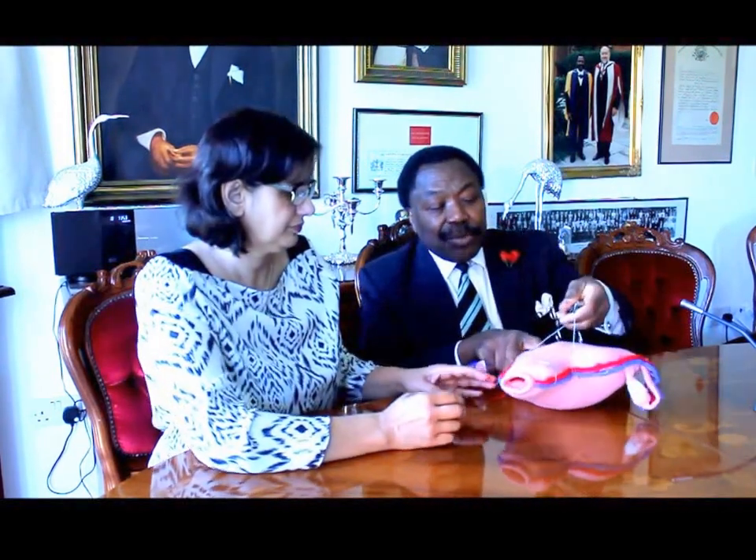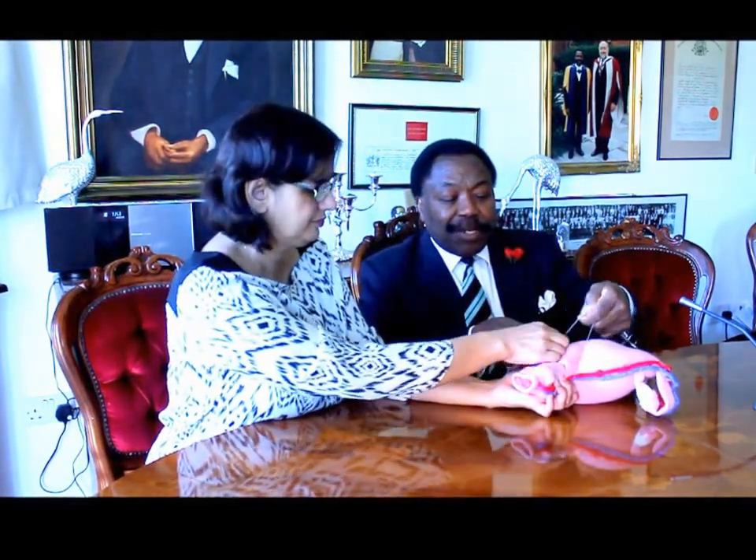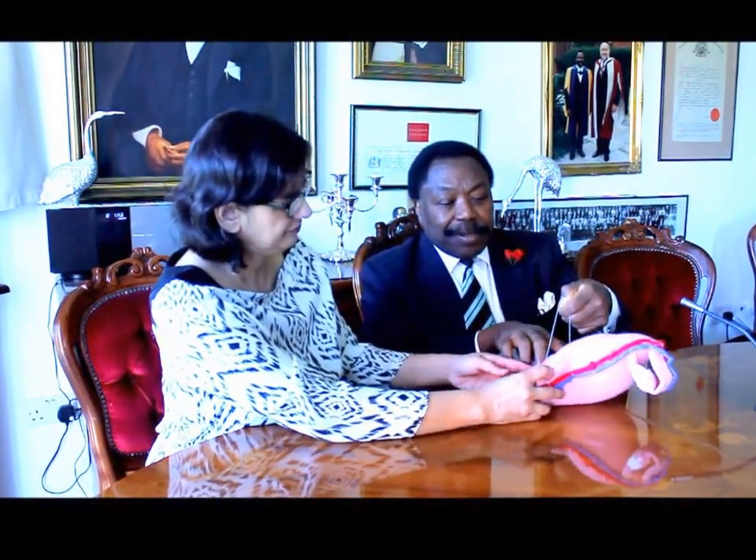You will see the two limbs of the suture surfacing. The assistant or surgeon will squeeze or compress the lower segment while the assistant checks that the vagina has been occluded. Some degree of tension is exerted on the suture materials. If you let go, you see this compression of the lower segment is achieved, with the vascular pedicle included on each side, giving control.